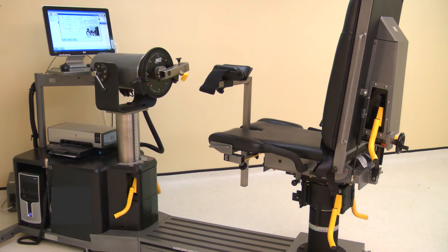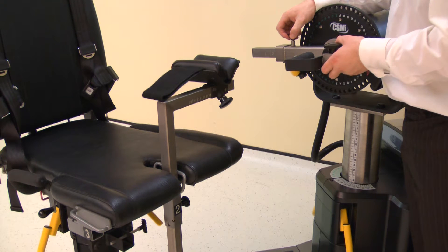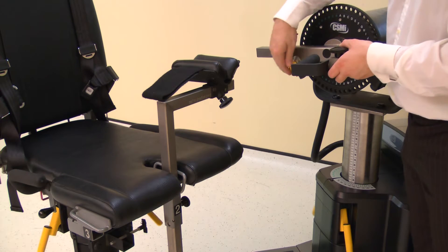Install the wrist shoulder adapter into the short end of the input arm. Ensure the handle faces away from the dynamometer face. Pull the locking pin to allow full installation. Secure with the locking screw.